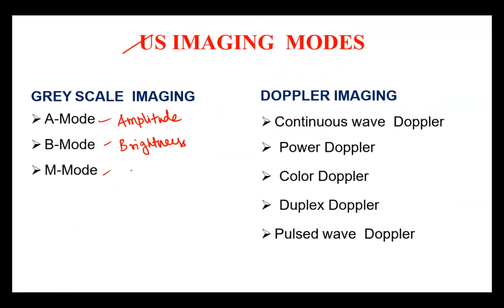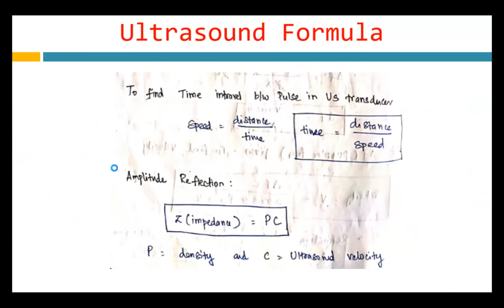Yes, who is that? Oscar. Yes, good. M is for motion mode. Okay, so I have another slide for this particular topic.